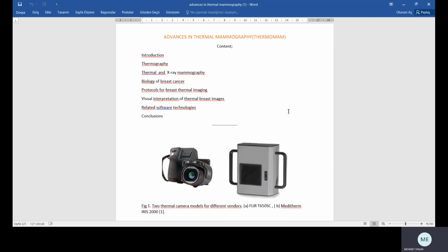The general interpretation from these protocols is that with few and mild abnormal findings, the categorization is towards normal and likely benign. With increased abnormality, the observation tends toward increased suspicion of malignancy. Another important point to note is that benign disease also exhibits some abnormal thermal vascular and non-vascular criteria. The diagnosis of benign conditions is made by follow-up thermography over a few months, by which time the abnormal thermal findings change, reduce or disappear.